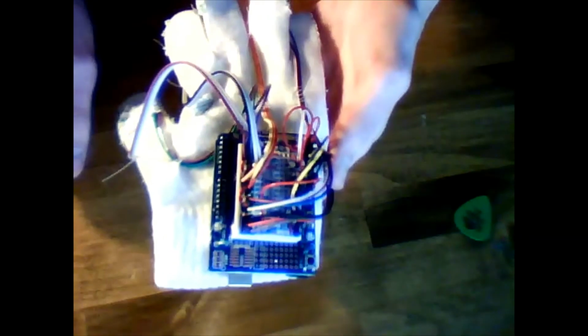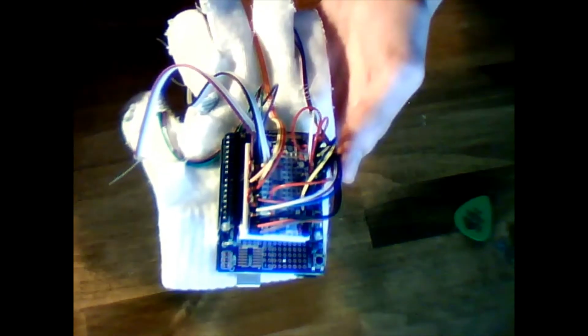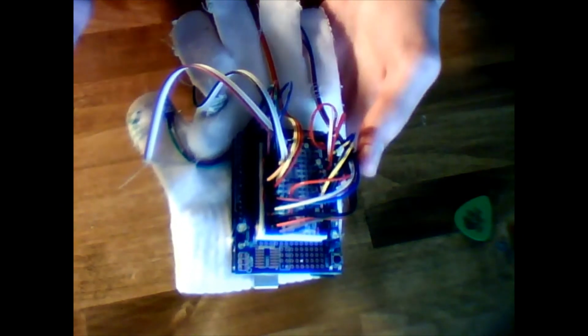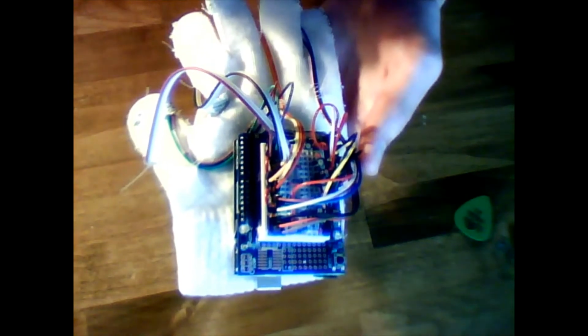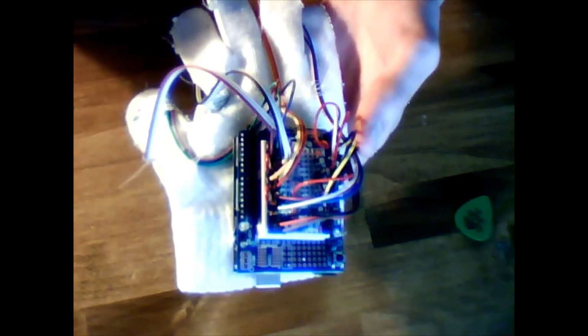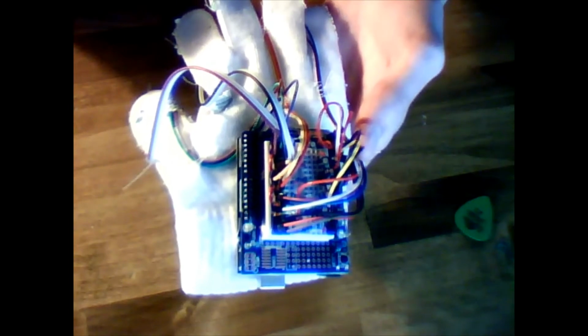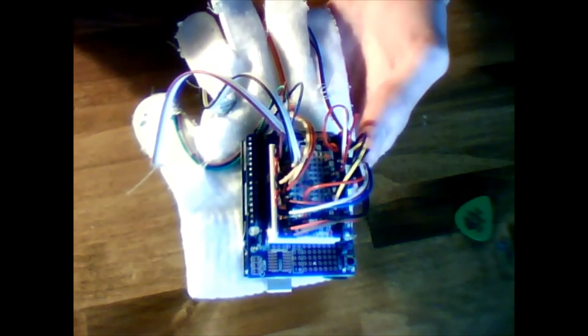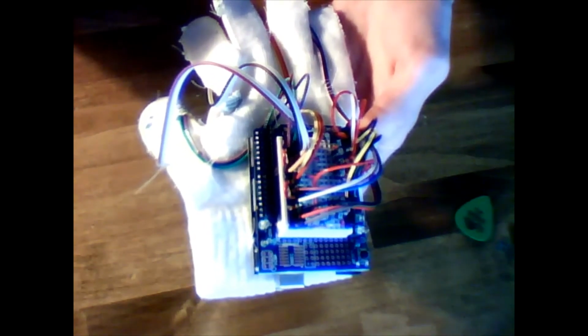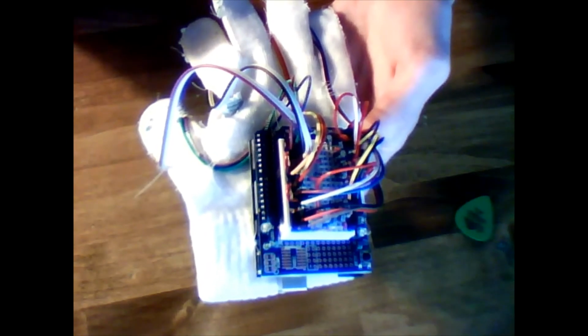To utilize our second sensor on the thumb, we also added an additional magnet on the side of the index finger. The signal from this is then sent into our circuit board, which contains an RC low-pass filter. As the signal is sent into this filter, it goes through a resistor and a capacitor in series. The output is taken from the capacitor to ground. The capacitor will work to eliminate any high-frequency noise we may experience in our outputs. From here, our signal is sent to our Arduino microprocessor, which relays it through the serial port to our computer.